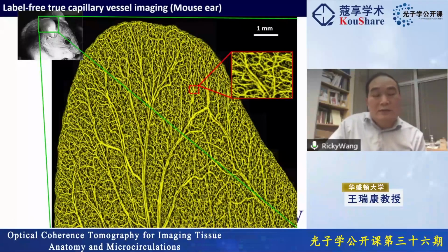Obviously my first thought when I did this experiment was that all downstream would become ischemic. However, that's actually not true, because all biological tissue is really smart, okay? If you cut this, the blood flow in the downstream does not change at all.